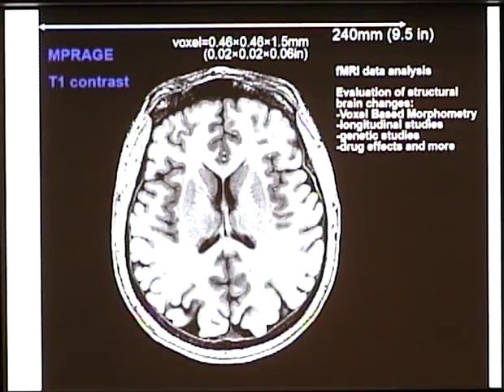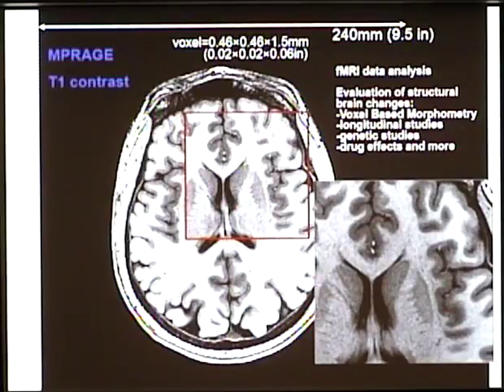What they use them for in the hospital is mostly structural imaging, to see if there are any abnormal changes inside the brain, like a tumor, but they don't have the capability for running this at such high resolution. But anyway, this is structural imaging, so we can get the whole brain information. I'm showing you only one slice, but really we have many slices like this in 10 minutes or so. I'm just showing you this as eye candy, to show how high quality it is, how detailed the information about the brain structure is.